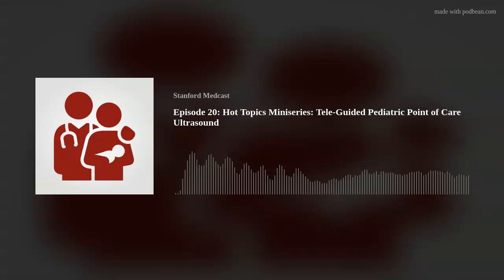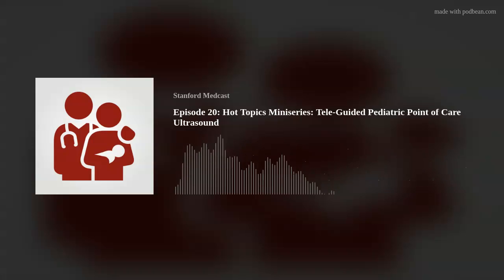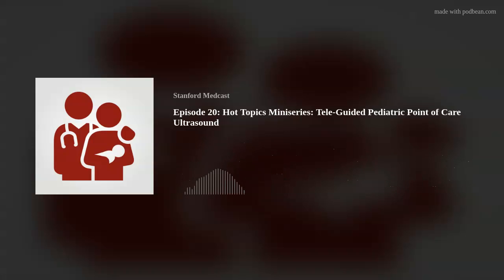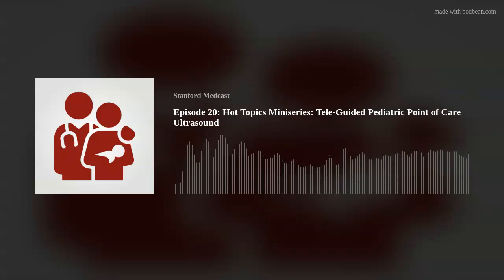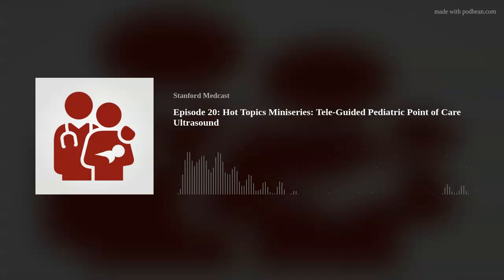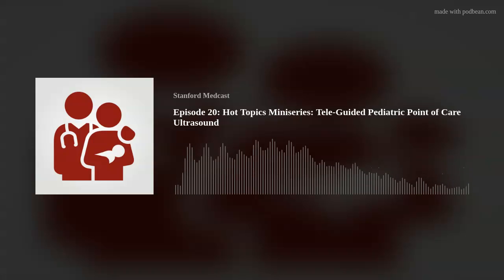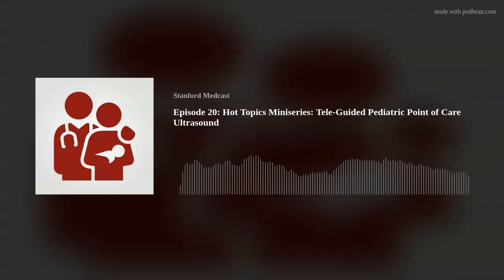To begin our conversation, I'd like to start with you defining what is point-of-care ultrasound. So point-of-care ultrasound really has come to mean many different things to many different people. But initially, the scope of this was to make a clinical diagnosis at bedside, right then and there. That's the most classic definition of point-of-care ultrasound: performing an ultrasound while you're caring for the patient and using that information to make clinical decisions on your patient right then and there.